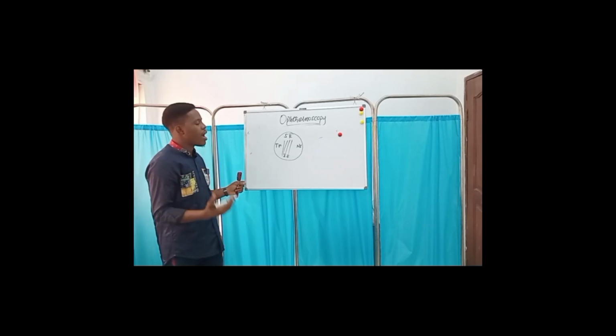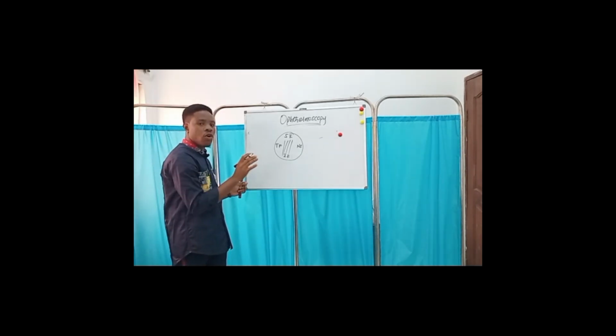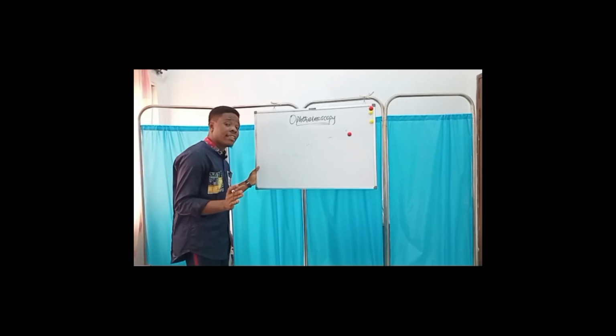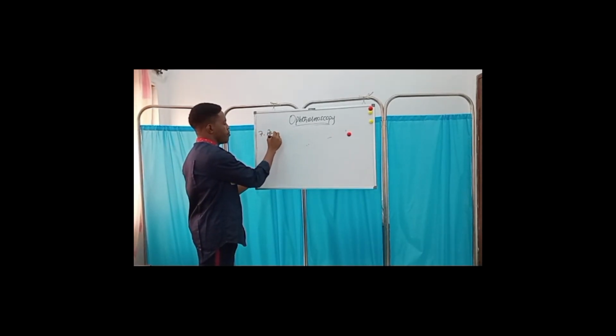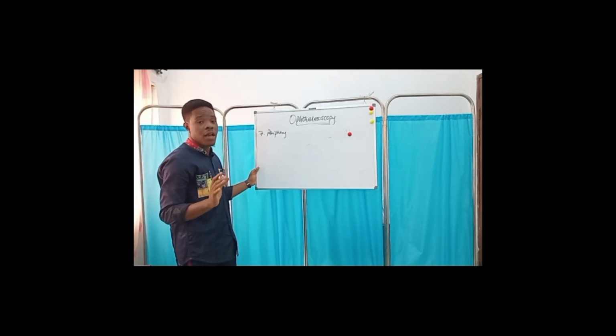Also, we're looking at microaneurysms at the blood vessels. We see little outpouchings. These are called microaneurysms. So this is what we look out for in the fundus. After we are done examining the fundus, we want to look at the periphery. The periphery is best examined when the pupil is dilated. It helps us to see the whole retina well. We can note retinal detachment and vitreous detachment.